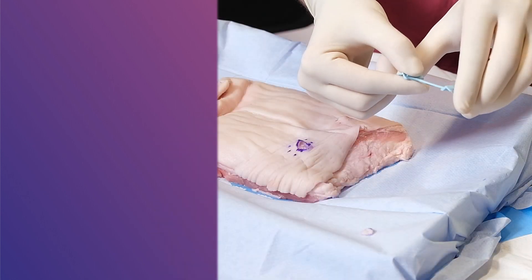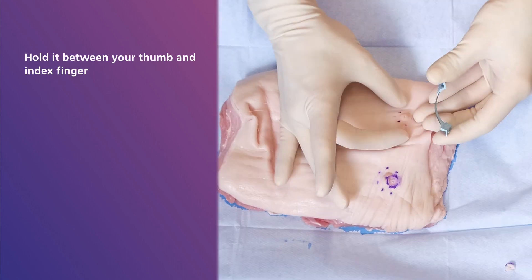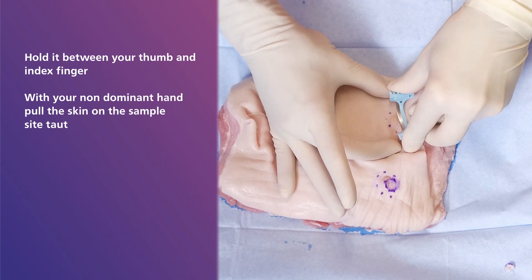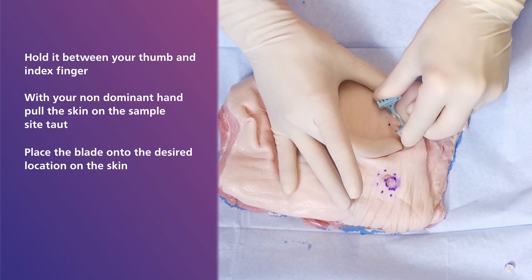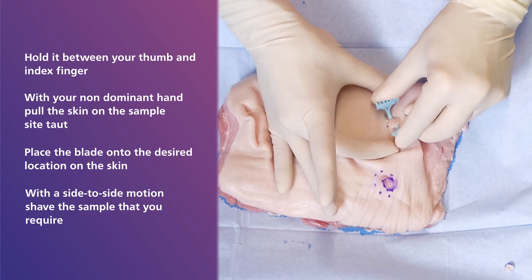To use a derma blade, hold it between your thumb and index finger on your dominant hand. With your non-dominant hand, pull the skin on the sample side taut. Place the blade onto the desired location on the skin and with a side to side motion, shave the sample that you require. Make sure you use smooth, purposeful motion rather than jagged movements.